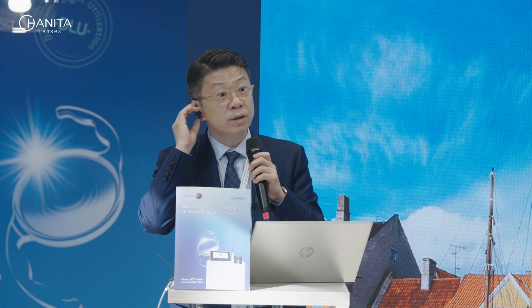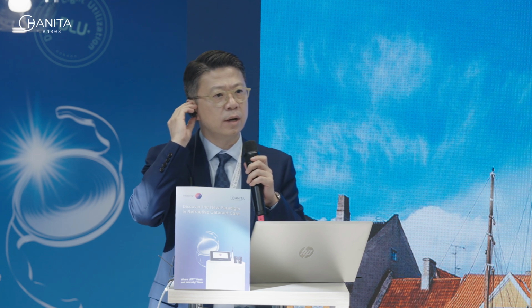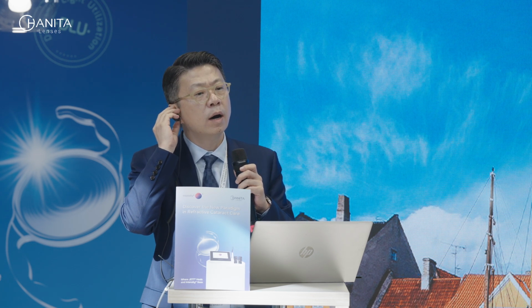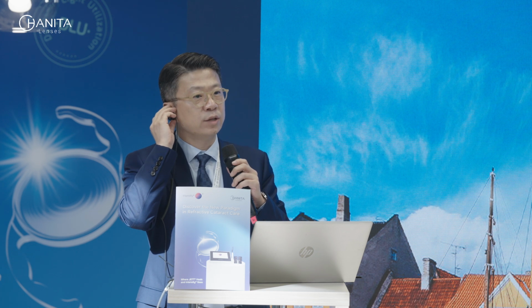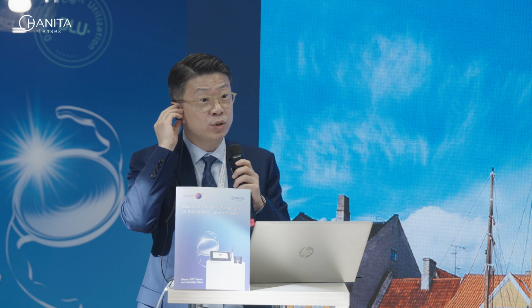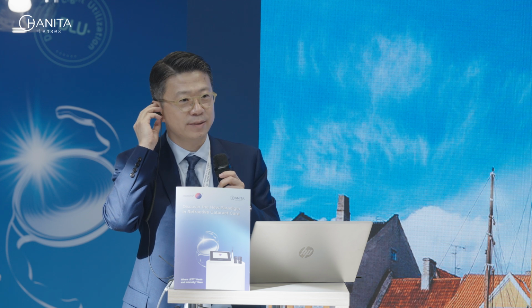The refractive results are different from different IOLs. Is that right? Yes, exactly. The Intensity pentafocal IOL usually gives patients seamless vision from far to near. So with the newly defined ISO 2024, yes, a continuous vision range.